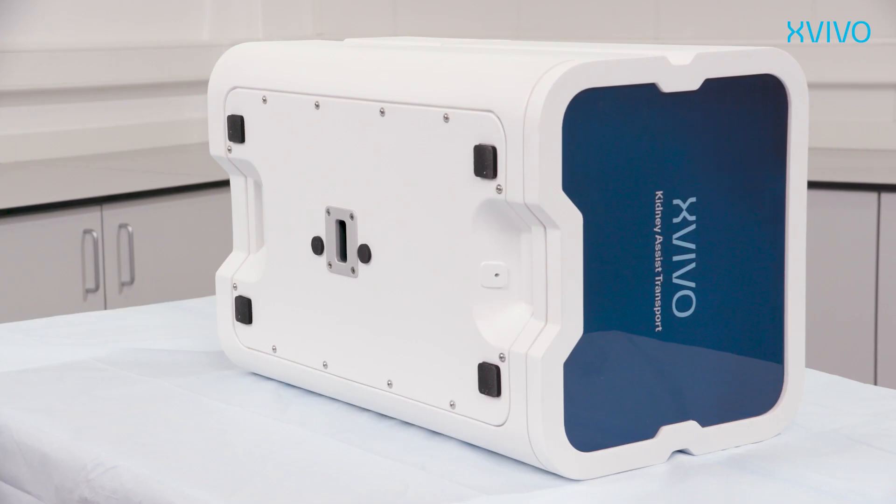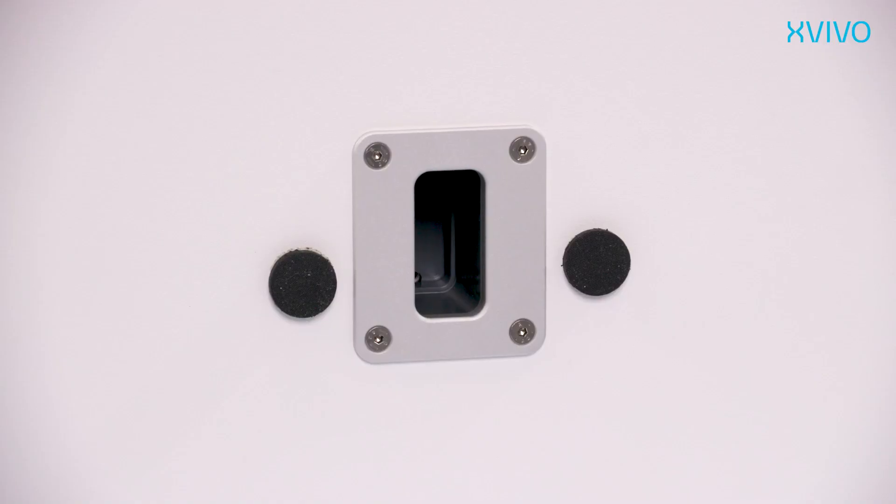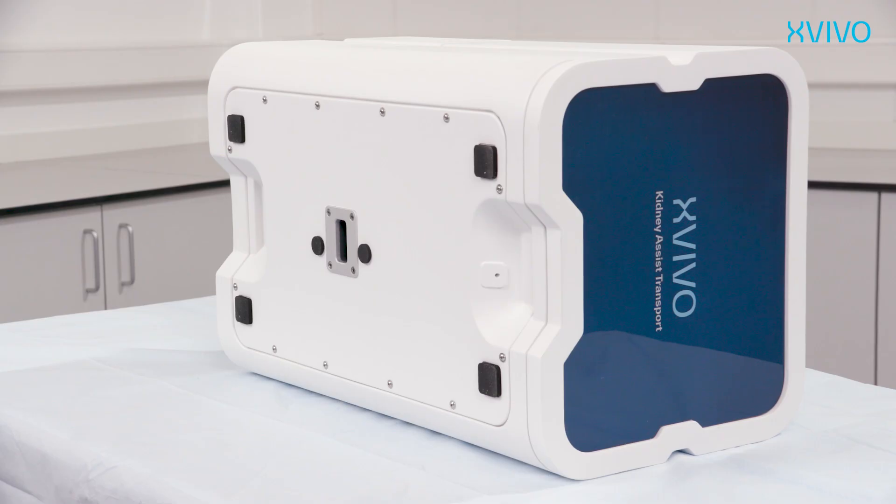At the bottom of the device there are two vents for oxygen. These vents are used to release oxygen from the perfusion cartridge, which prevents accumulation of oxygen inside the device. Please assure that these vents are not blocked during use.